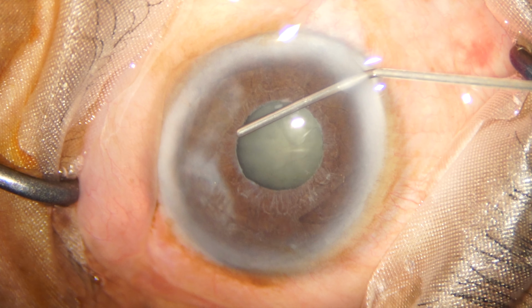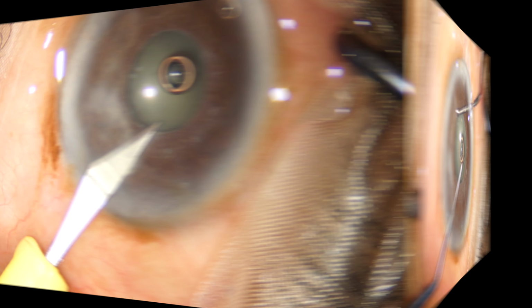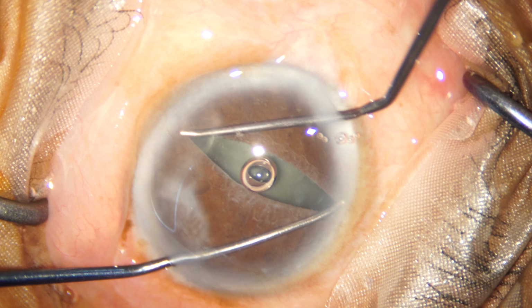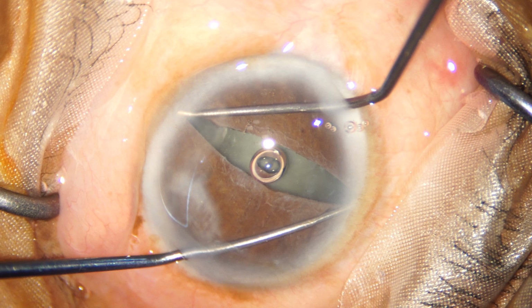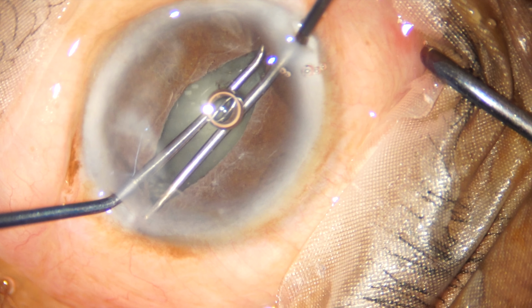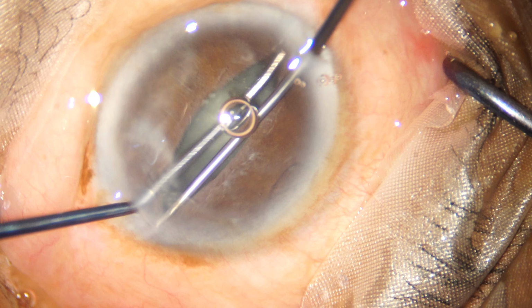So we begin by making one side port, and we are now injecting 1.4% sodium hyaluronate. After making the second side port, we begin the manual dilatation of the pupil. The manual stretching is done with two Y instruments, and as you can see, as we're stretching them 180 degrees apart, you can actually see the stretch at the sphincter pupillary muscle.